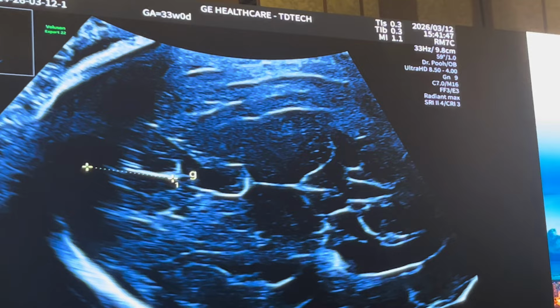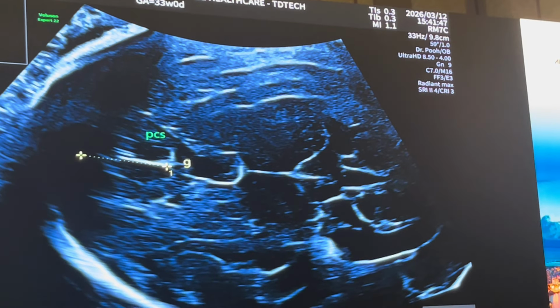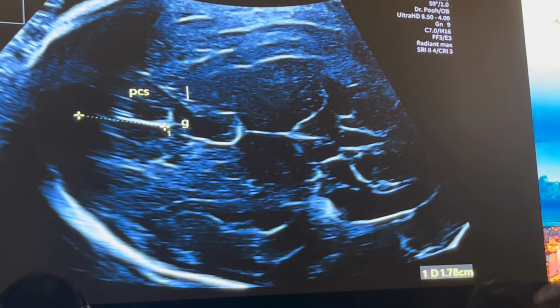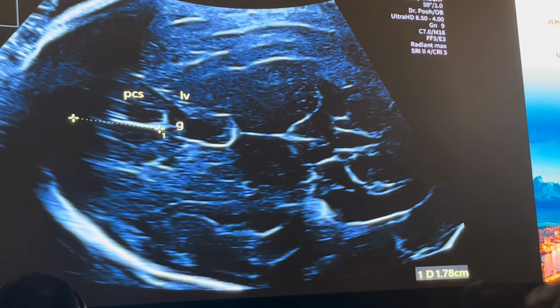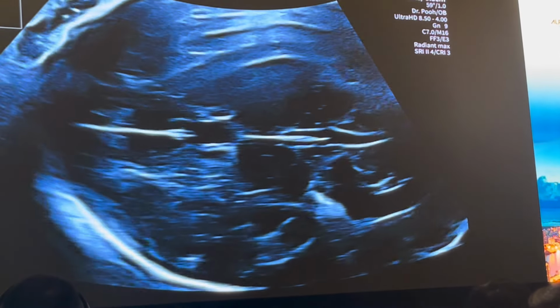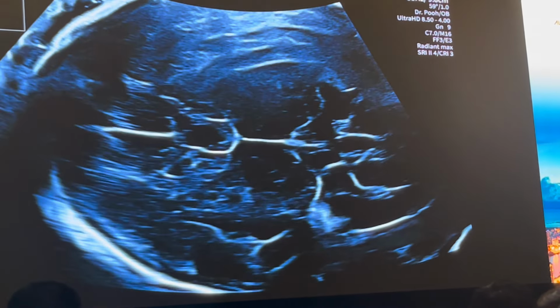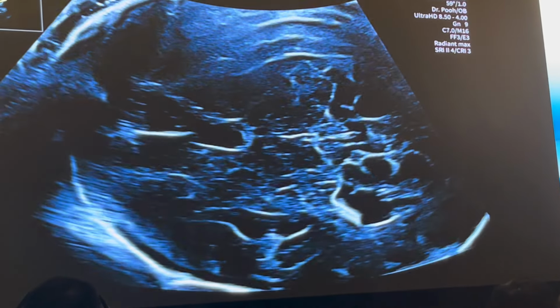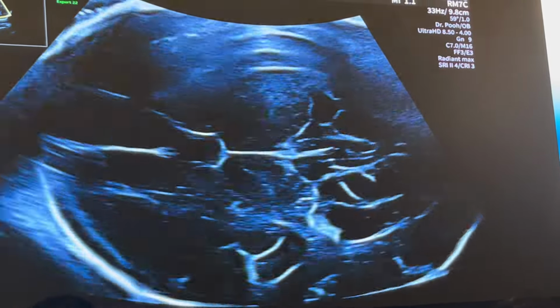But Simon, for example, before 18 weeks of gestation, sometimes we cannot see this septum pellucidum. That's a good point, and I think in terms of today, it's an important message which we need to convey, that sometimes you will find that you cannot see the CSP. If you read in the textbooks, it says the CSP appears around 15, 16 weeks of gestation in many pregnancies, but in some, 17, 18 weeks. Would you agree that you cannot see the CSP? It appears a little bit later?